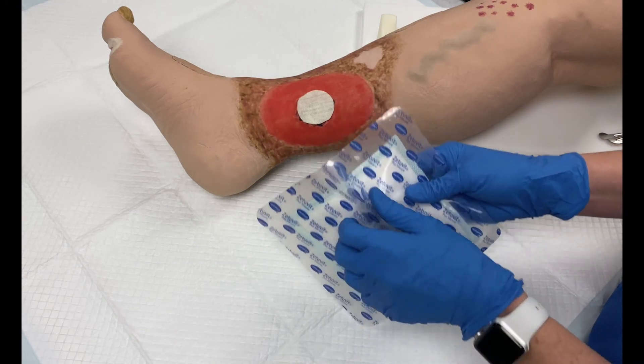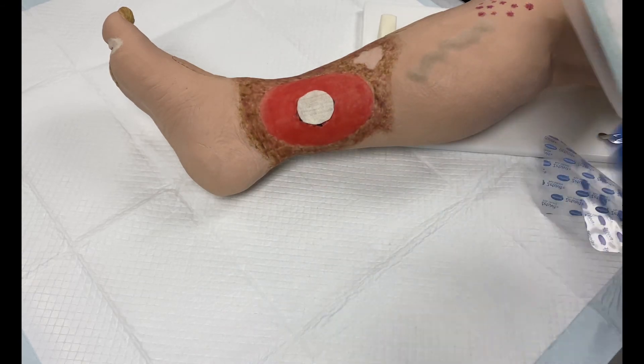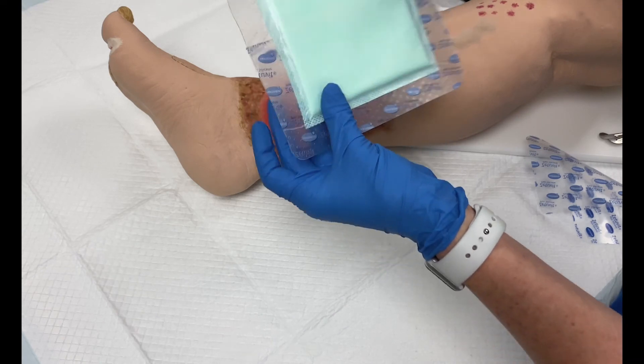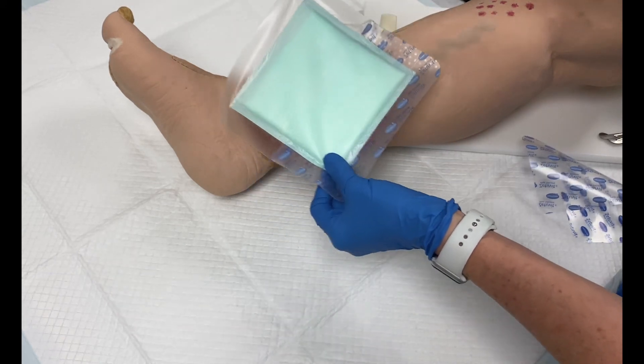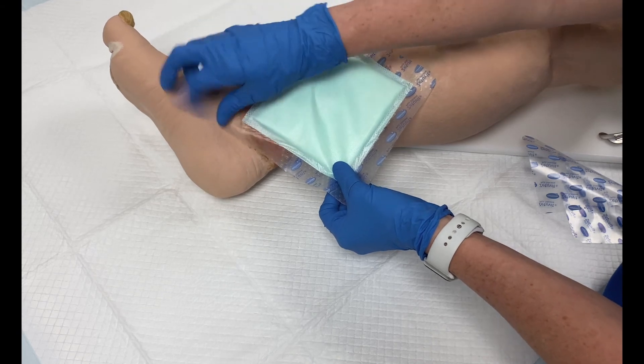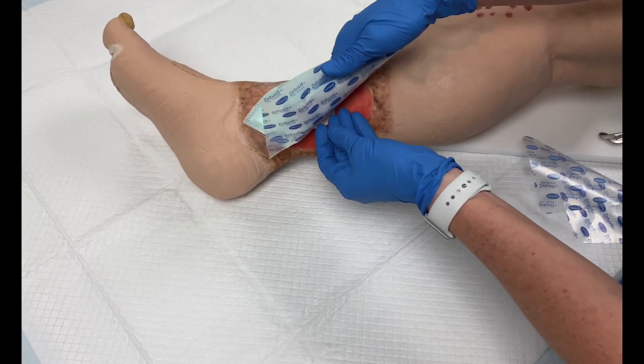First, remove release film number one. Gently secure the dressing to the skin and smooth the edges. The pad of the dressing should overlap the dry surrounding skin by at least half an inch.